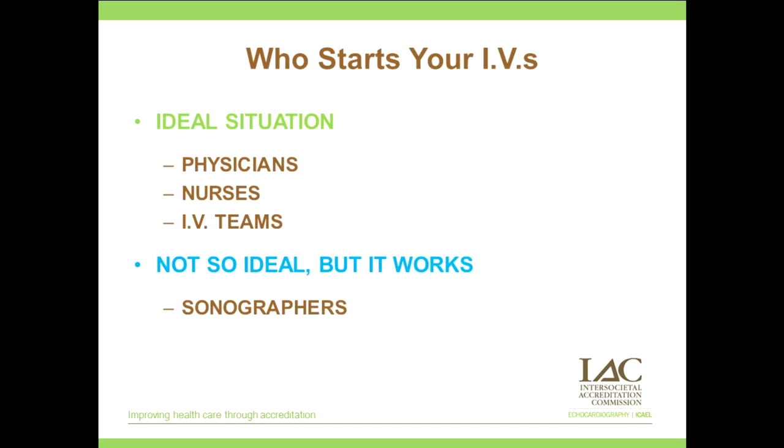So in situations where personnel that start the IVs are not readily available, yes, a sonographer with proper training can perform this task. Of course, this all depends on your institution's policy, like I mentioned, and your local and state requirements. Some of them will not allow you to, but if they do, we can start the IVs.